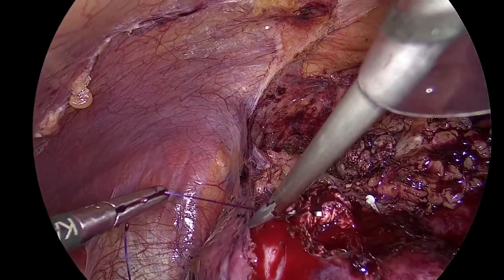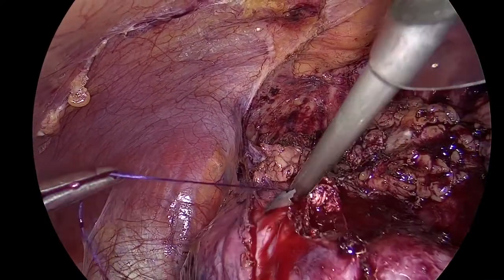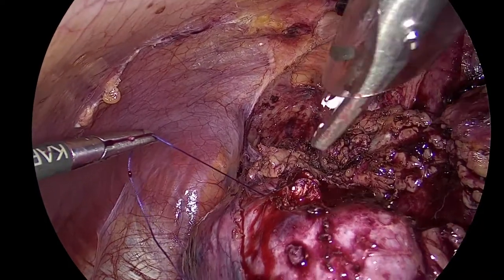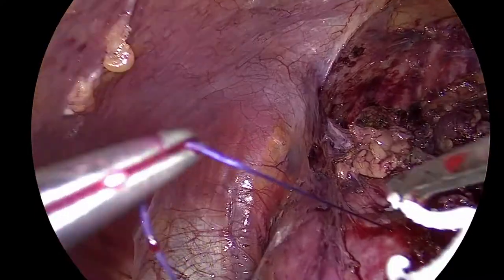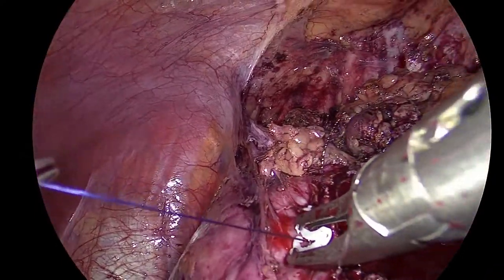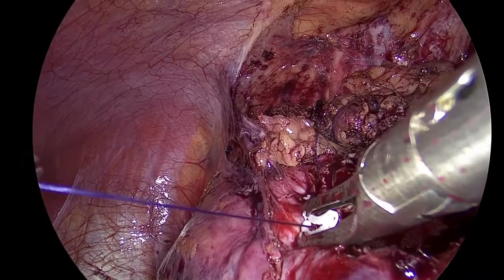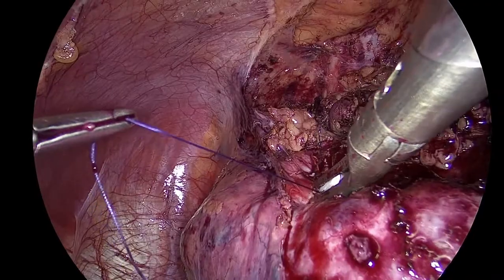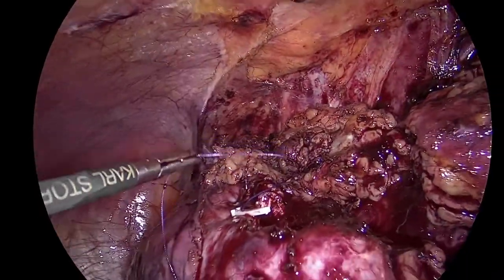I think it's very useful in small exophytic tumors. You avoid bleeding, but sometimes with the cut with the cold scissors you identify better the surgical plane, the pseudocapsule, to perform the dissection. See, here it's important to pull the suture and to clamp like this. Give me the suction.